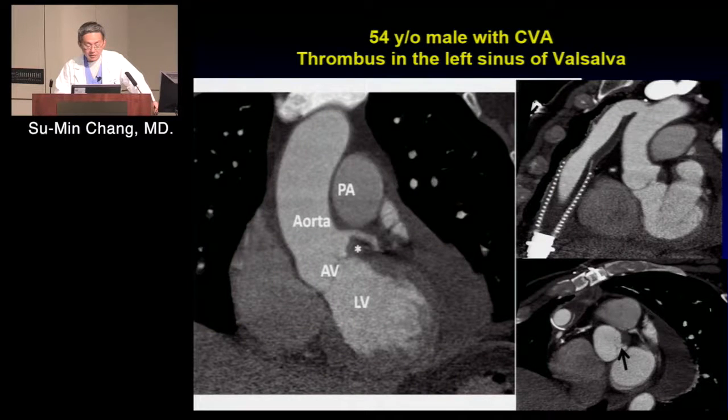One of the things we're paying more attention to is aortic root thrombosis. It's not strictly a direct problem with the LVAD, but the problem with the aortic valve opening creates a certain milieu which promotes thrombosis. And if you look at the literature, it's always reported that it most commonly occurs in the non-coronary sinus, supposedly because there's no coronary artery, so there's less flow in that sinus. That's mostly based on some short series of surgical findings and some by echo. And we found out with our experience that's not the case. It's not common. I think we've seen about 5 or 6 cases out of 90 with HeartMate II. What's interesting, we saw, I think, 1 or 2 with HeartMate 3, out of the relatively fewer number of patients that we've done.